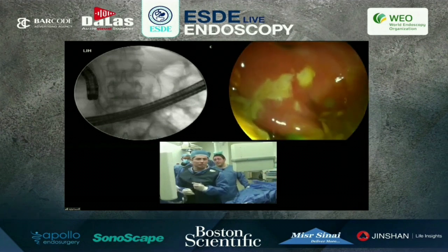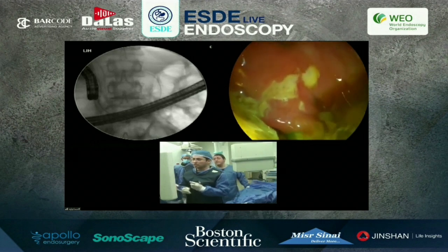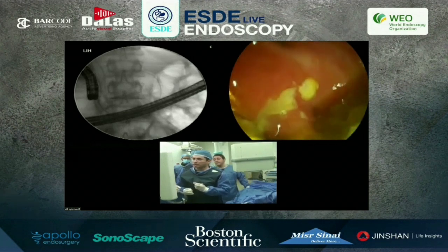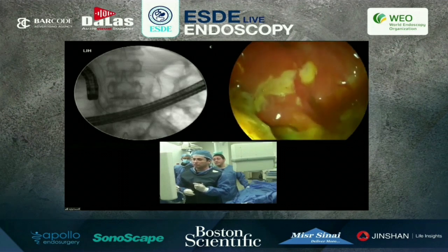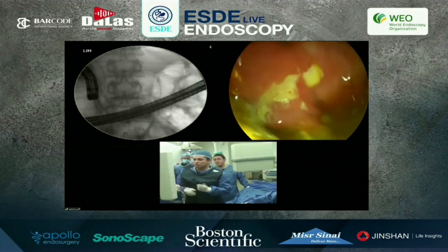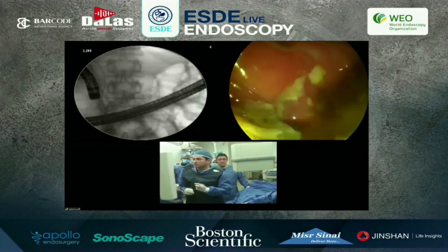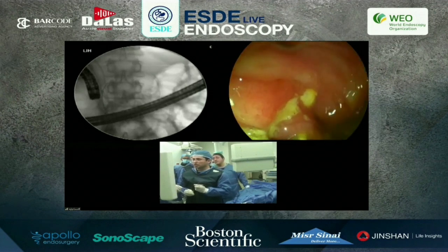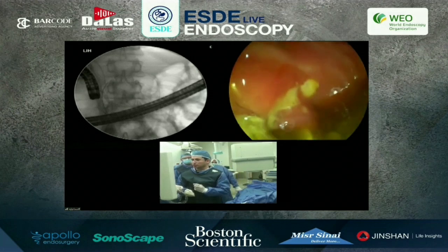Yes, this is one of many options for this patient, to do EUS-guided gastrojejunostomy, and also a duodenal stent is another option. Especially as we did biliary drainage first, so we can now introduce the duodenal stent without fear of causing biliary obstruction to the patient.